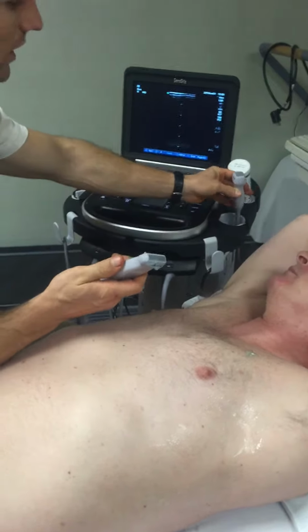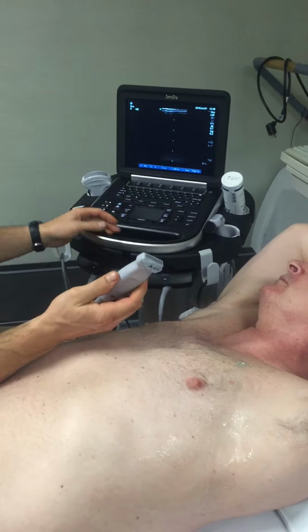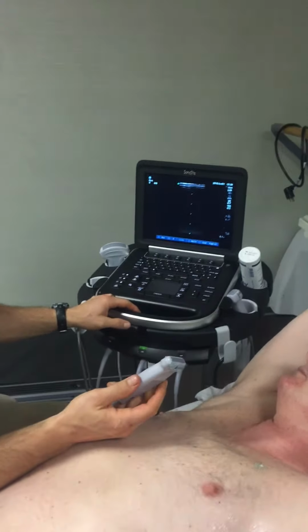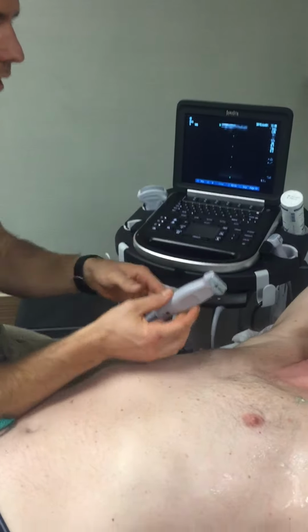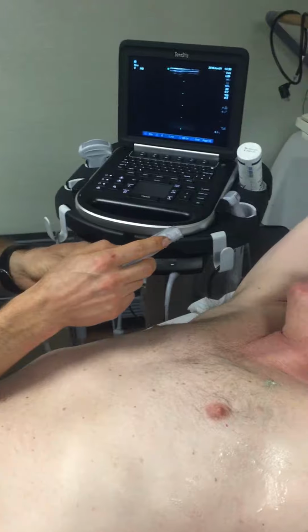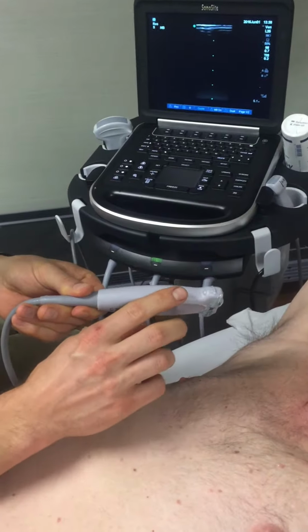The linear probe shows a lot more detail at a shorter depth, thus you'll get a better view of the pleura, especially anteriorly. But it's up to you, just got to adjust your gain and your depth. The indicator you can see here I'm pointing to, you want that towards the head of the patient.